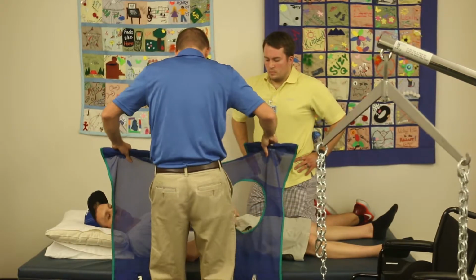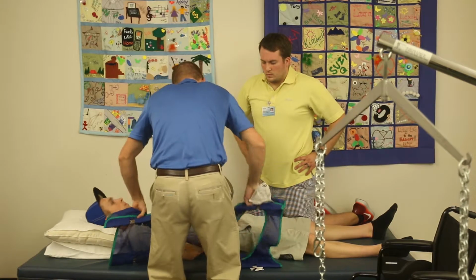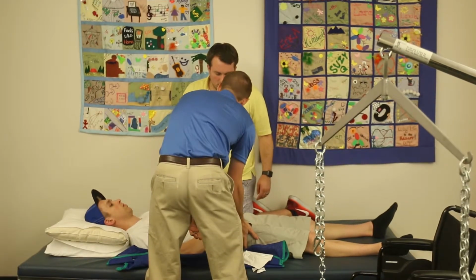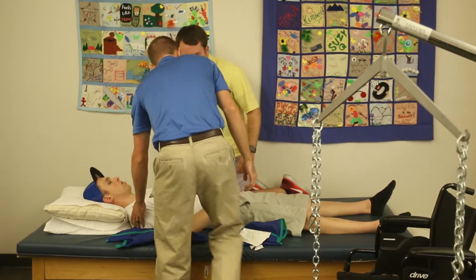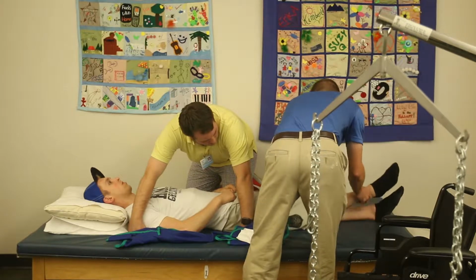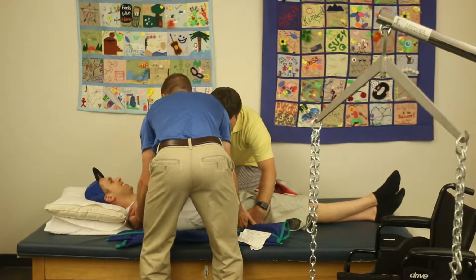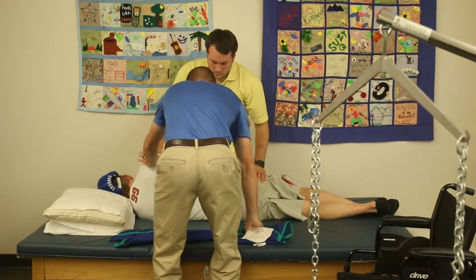So what I'm gonna do first is I'm gonna roll you up toward Richard on that side. So Rich, if you wanna come right here, and I want you to put your hand right here, right below the hip area, and then the other one's gonna be right here, and you're gonna assist in me rolling him up on his side. Okay. So before we do that, let's get your legs situated so you're ready to roll. And on a count of 3, we're gonna tip him up on his side. So 1, 2, 3. Okay, that's good there.